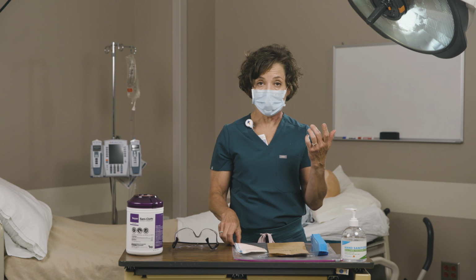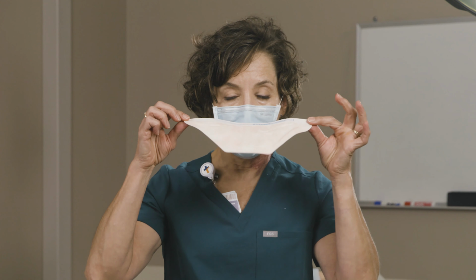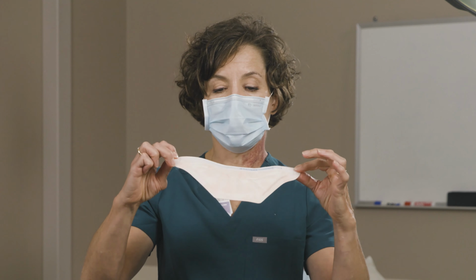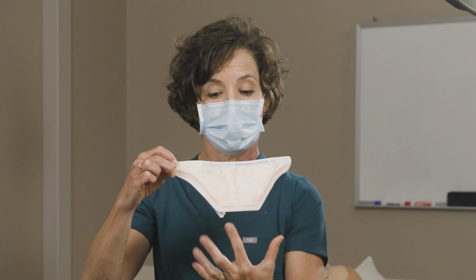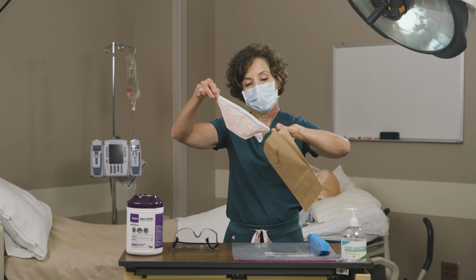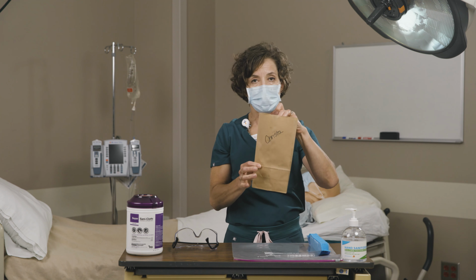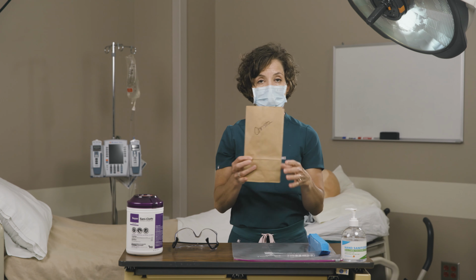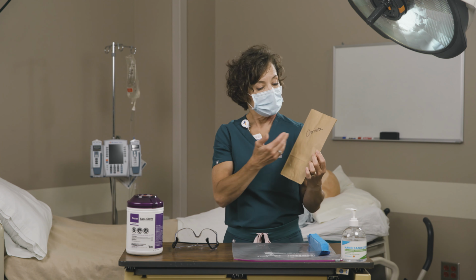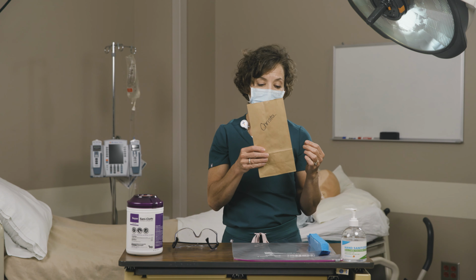As we demonstrated earlier in the video of how to doff it, once you get it doffed and off, you want to make sure and not touch any part of the front part of the mask, and have a brown paper bag and just gently place it in the bag. You don't want to place an N95 for storage in a sealed bag, but in a dry paper bag. So you just have your name on it, and then you can use this throughout the rest of your shift.